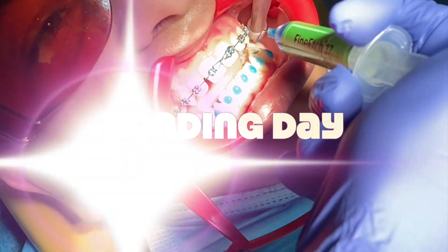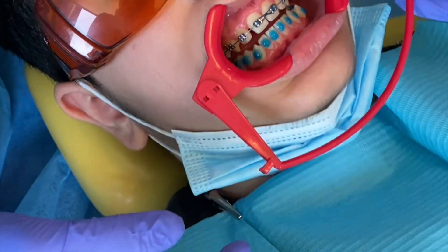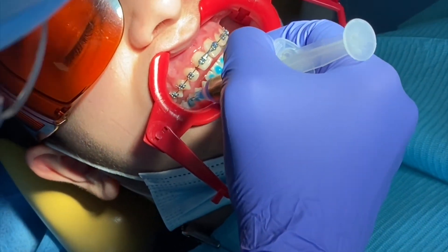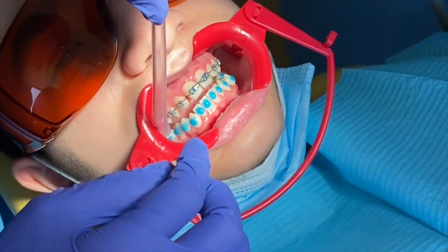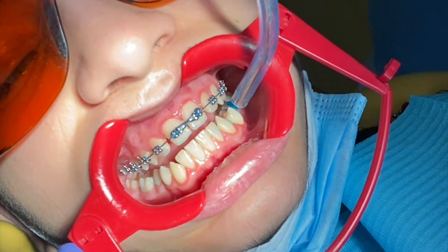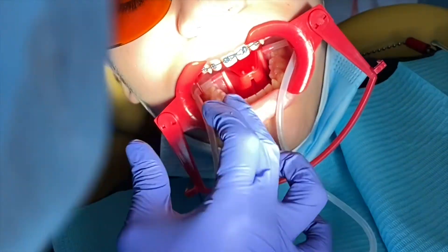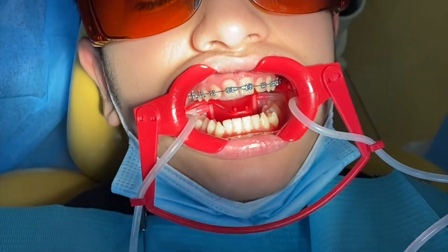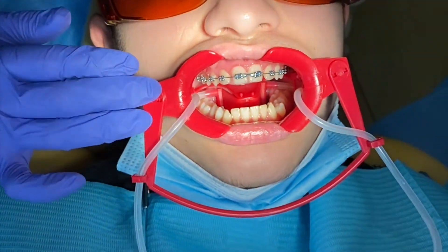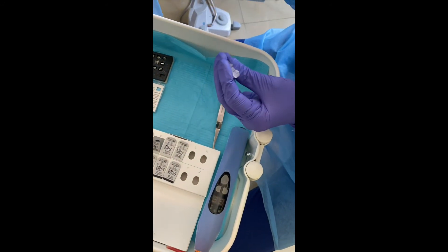On the day of bonding, we started with isolation. I like to use the Nola retractor because it has a tongue piece with suction built in, which ensures excellent isolation — extremely important for bonding. We then proceeded as usual with etching, waiting around 15 to 20 seconds, then washing and drying. The tongue piece is critical because it removes all saliva and controls the tongue, which usually causes difficulty during bonding of the lower arch.